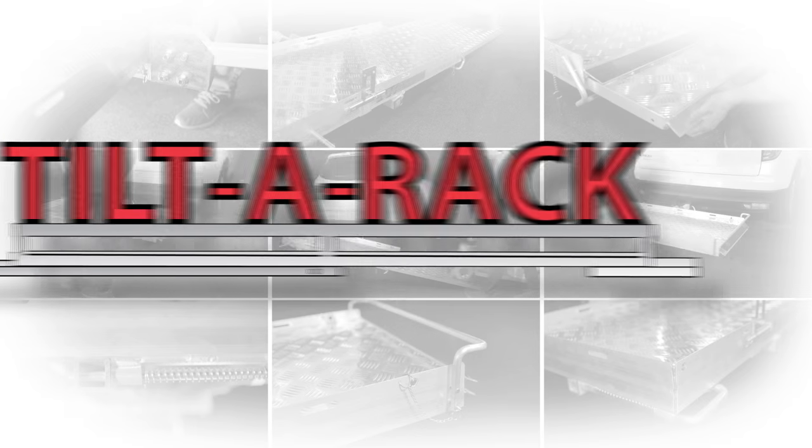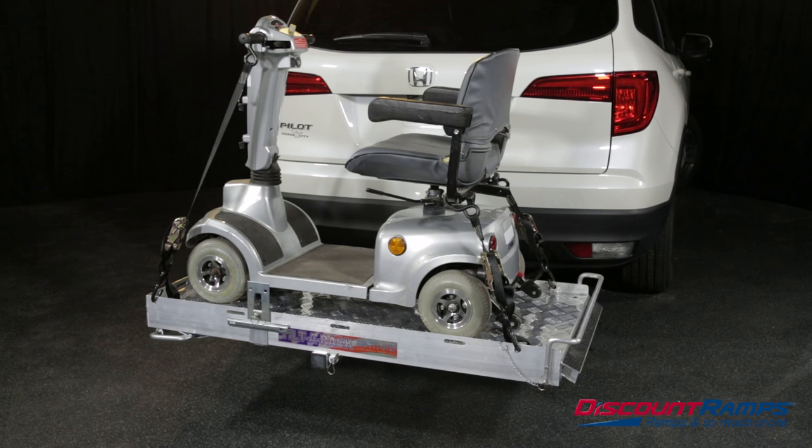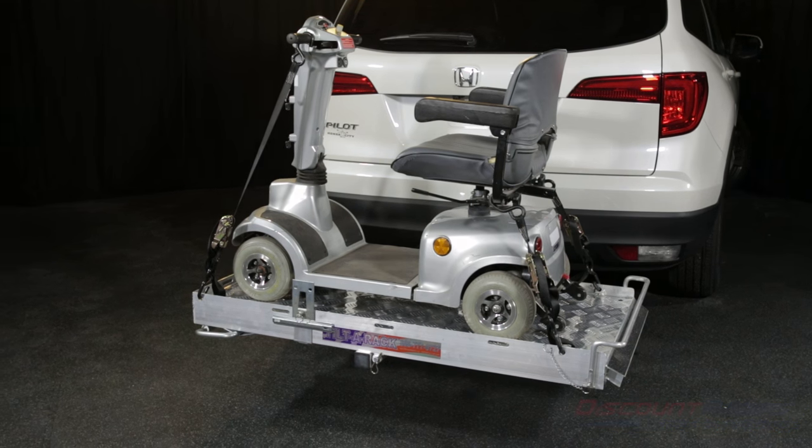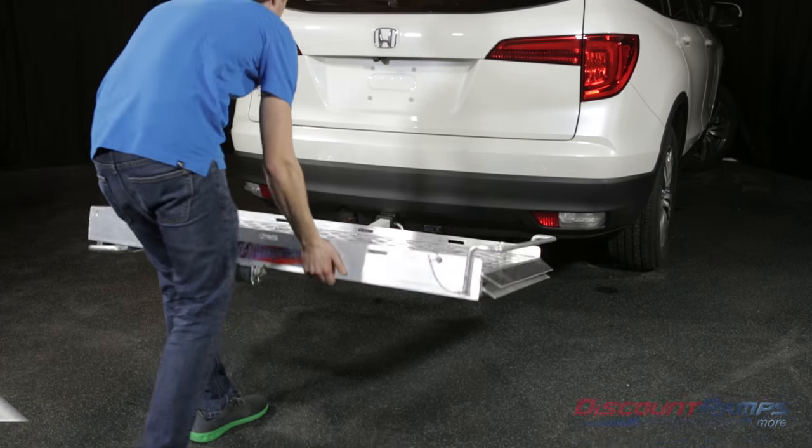DiscountRamps.com presents the Tilt-A-Rack Mobility Carrier. Compatible with 2-inch class 3 or 4 hitches, this aluminum carrier features easy single-person installation and operation.